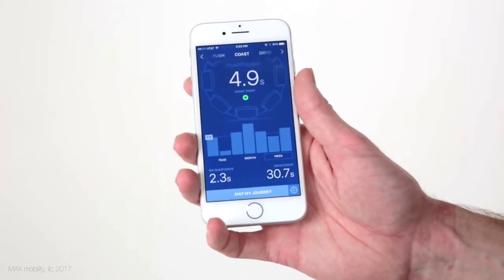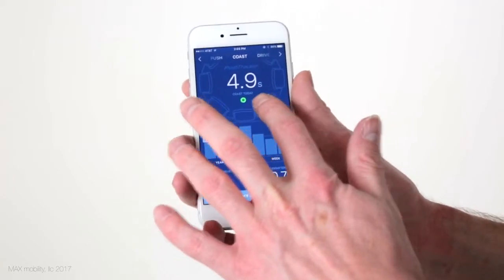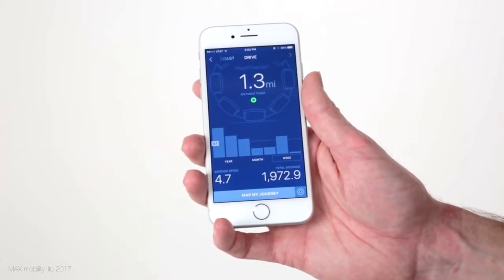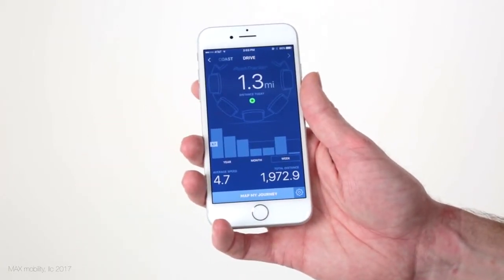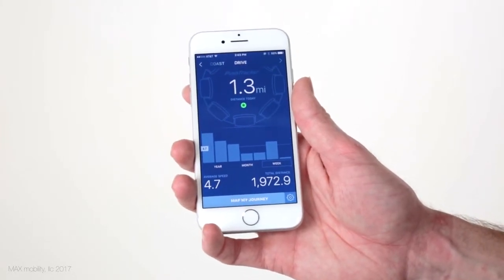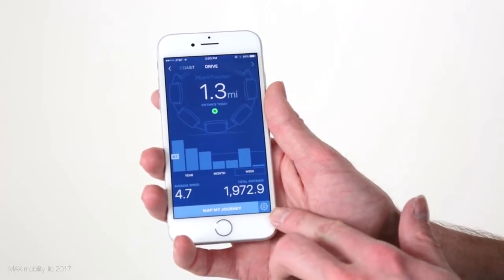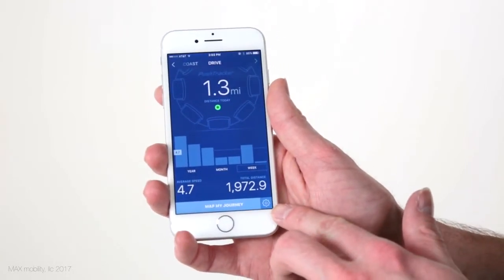Swipe to switch between the 3 dashes, the next being your coast time, and the last being your drive dash. This one shows information relating specifically to your SmartDrive, like average drive speed and an odometer for the total distance your SmartDrive has driven in its life. You'll notice the settings button that allows you to quickly change the same SmartDrive settings shown earlier in the PushTracker wristband settings menu, as well as get initial PushTracker to app pairing instructions, which is discussed in a bit.